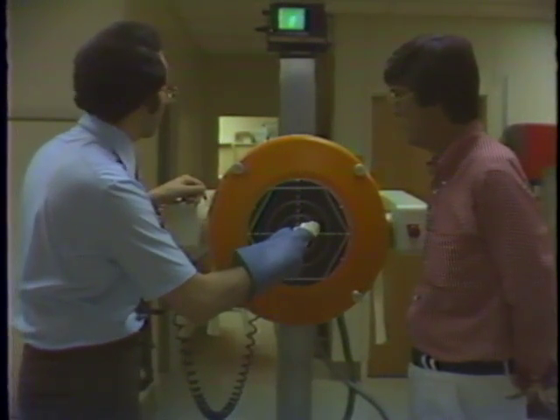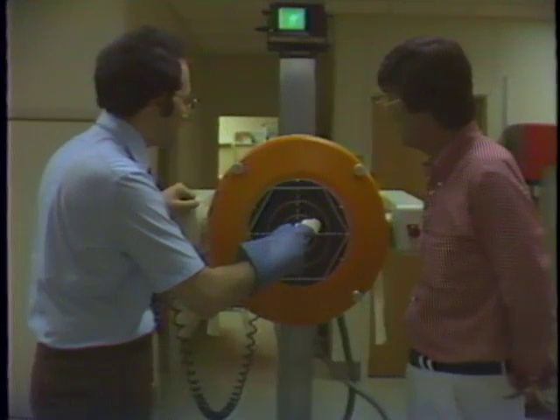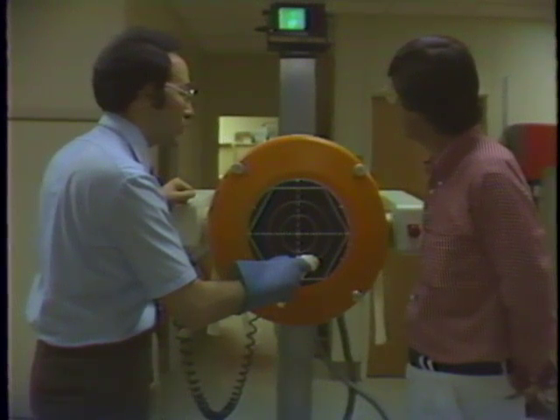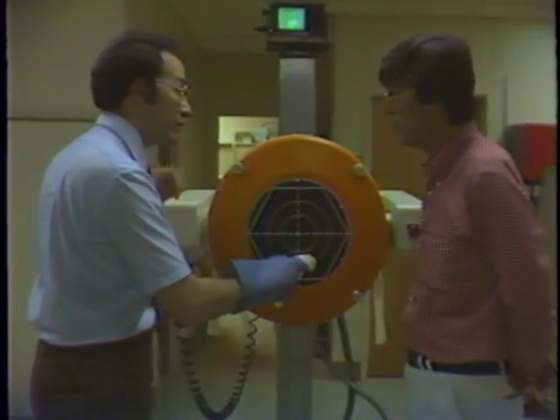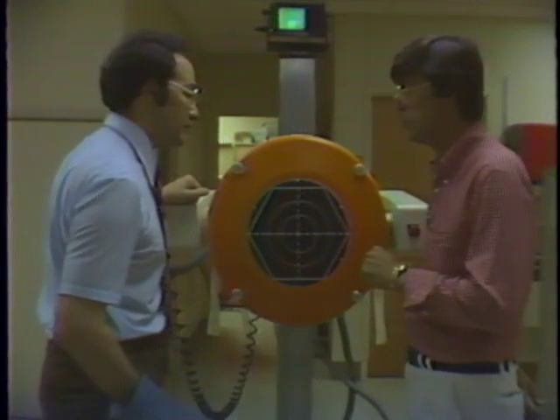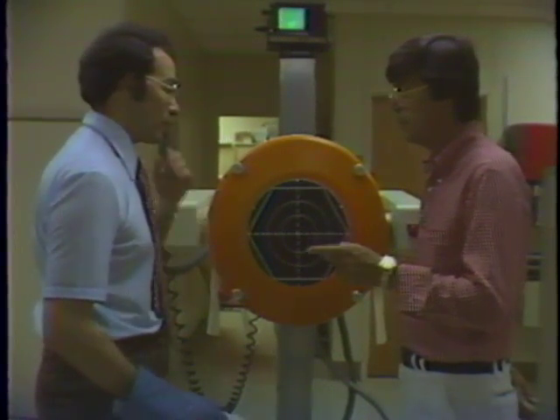Now if I hold this right in the center of the gamma camera, you can see on the display there that it's right in the center of the field. If I move this to one side, the display goes to one side. If I move it to the other side, it does the same thing. And up at the top or down at the bottom. So it can draw us a very accurate picture of where the radioactivity is and give us an image of an organ. So all of this information then goes to the oscilloscope screen on the camera where we take a time-lapse picture of it.